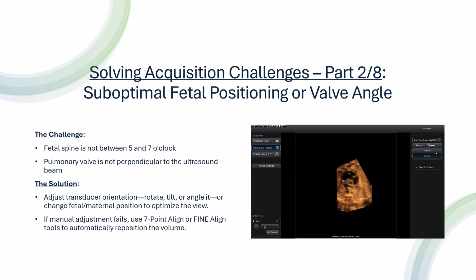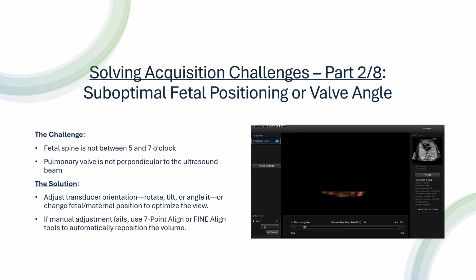As you can see, the short axis view of the right ventricle, the stomach view for situs determination, and the ductal arch. Beautiful, as you can see. This is the aortic arch and the bicaval view or vena cava view, where the superior and inferior vena cava open into the right atrium.